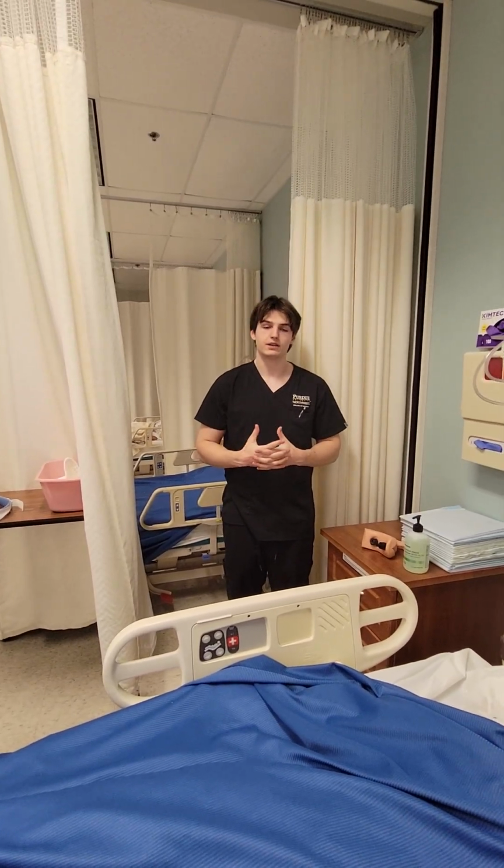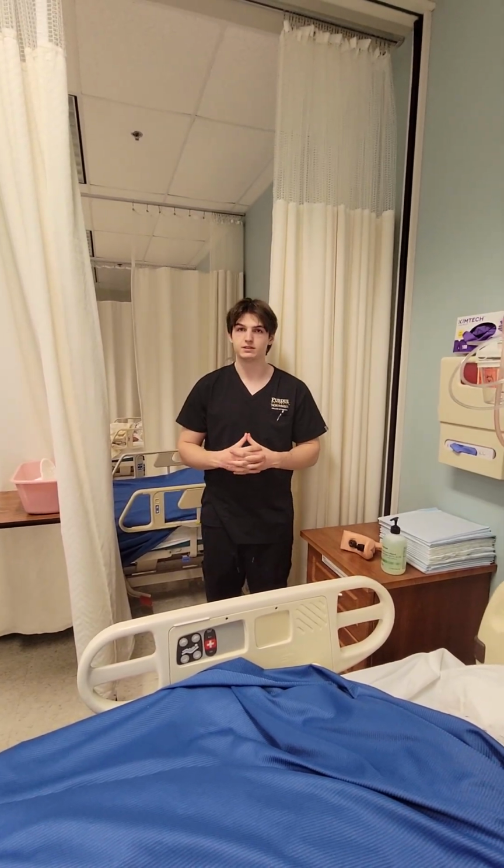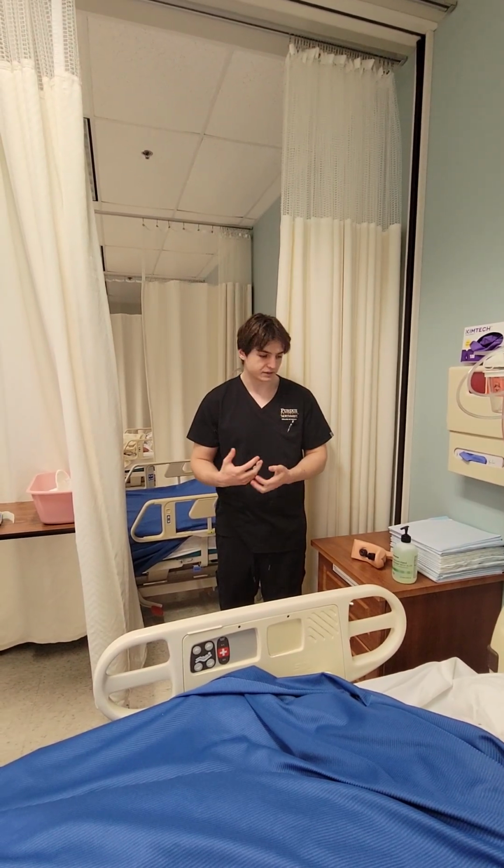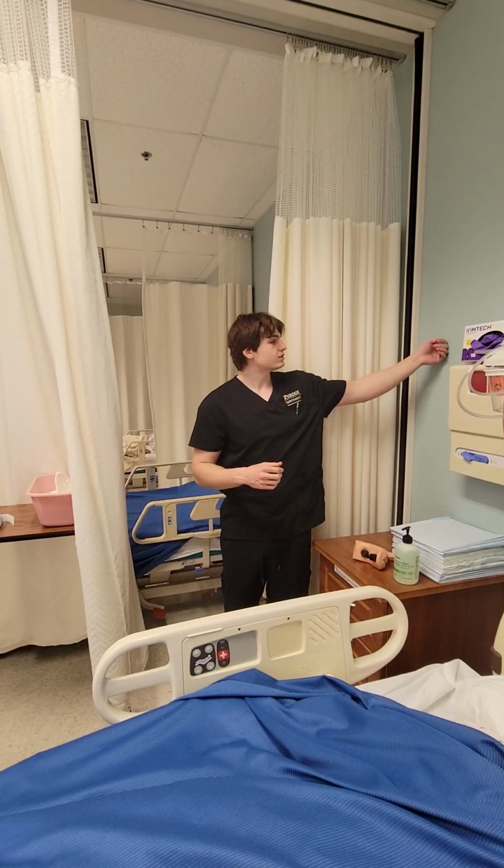Today I'm going to do a Foley catheter on my female patient, Mrs. Jones, as ordered by the doctor. This order has been done because she is experiencing some urinary retention. So I am now going to enter the room.